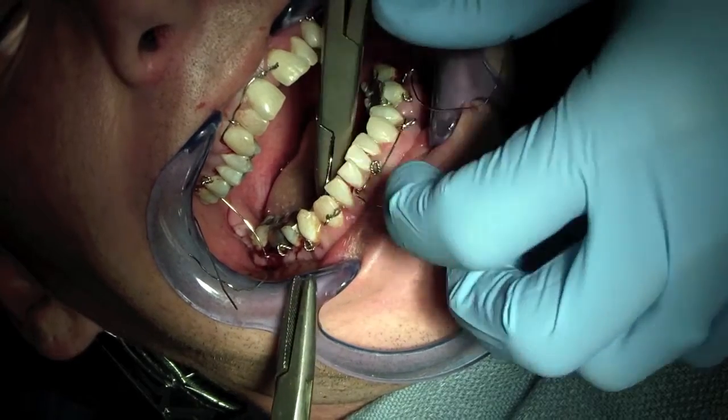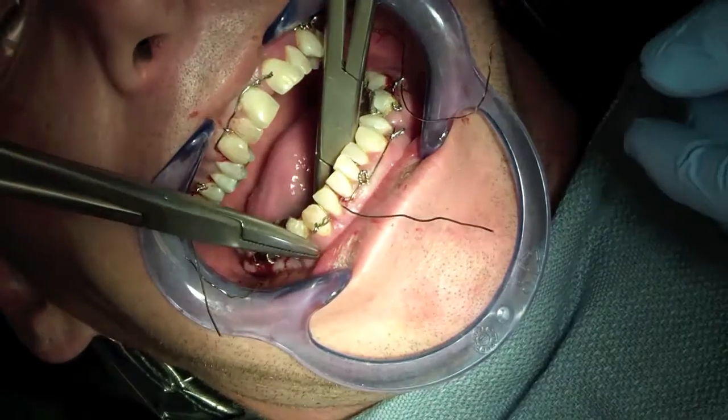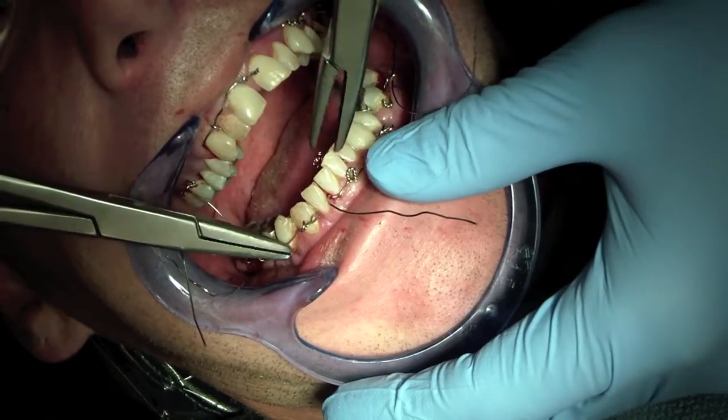The fracture is between the two premolars on the right side, and it's been about an hour and a half so he's starting to feel some pain. He's not sedated, just local anesthesia.